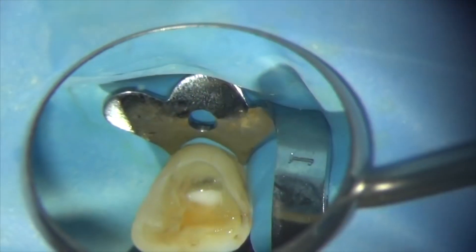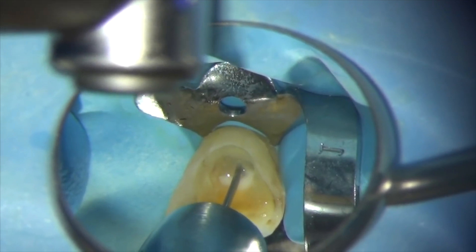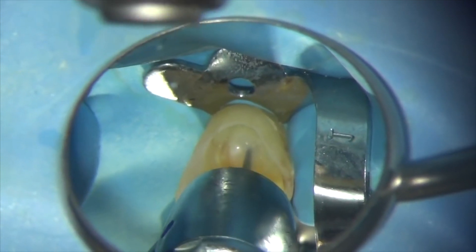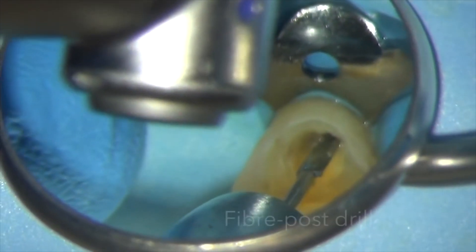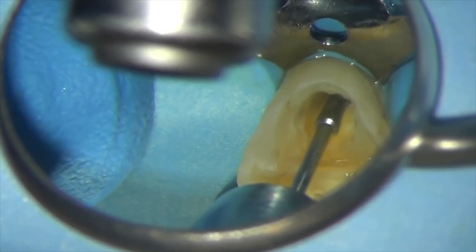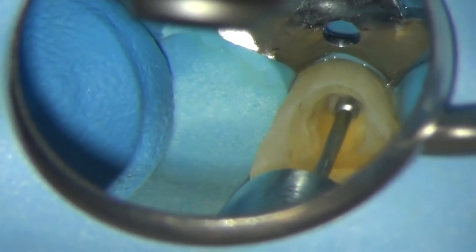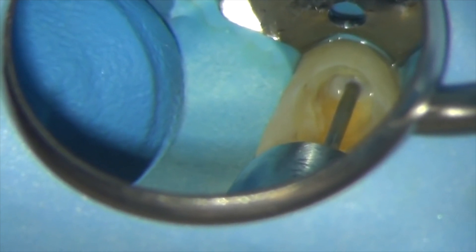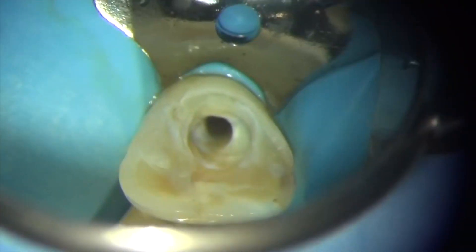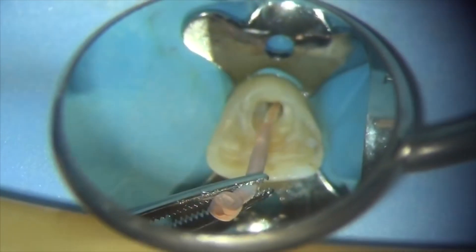In this case I'm going to place a fiberglass post, so I'm prepping the post hole first with the Gates Glidden burr to create a pilot channel and then with the tapered post drill. After disinfecting with three percent sodium hypochlorite, the root canal is then dried, obturated with vertically compacted gutta-percha, the post base and coronal part of the tooth etched with phosphoric acid, and then the post bonded using a dual-cure composite. I restored the rest of the access cavity with composite also.